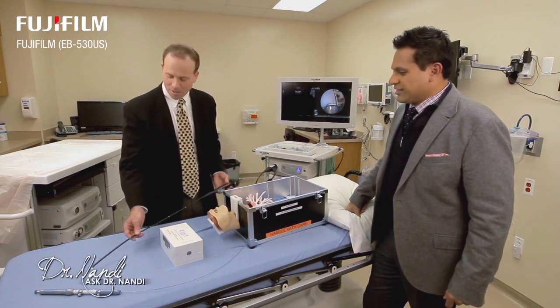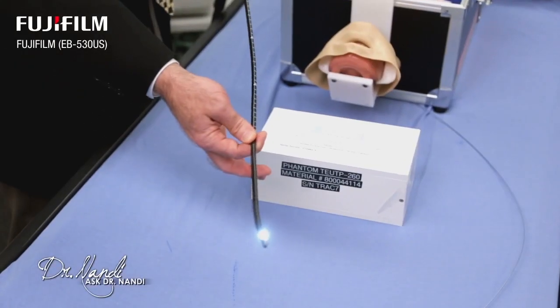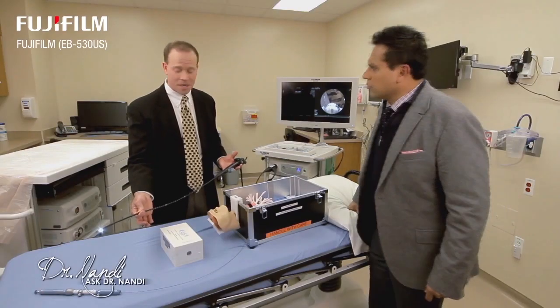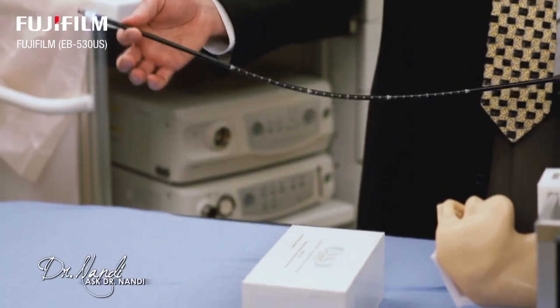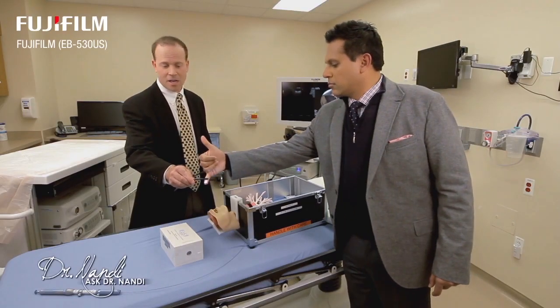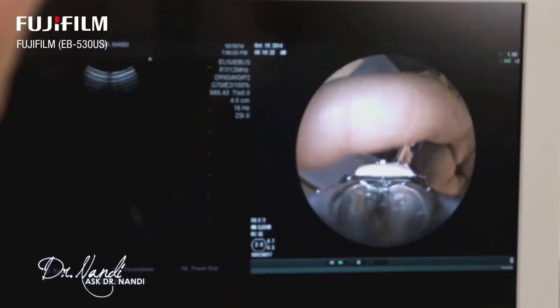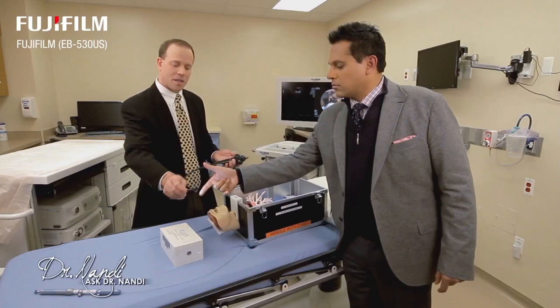It's a very nice bronchoscope. This is the Fuji model of the EBUS, and it incorporates the elements of the standard bronchoscopy, which is basically a video camera at the end of the scope that's about as thick around as a pencil. The camera and the detail on this is remarkable. Looking back at the screen there, we can actually see the outline of your finger, and without the light shining on, it's actually quite detailed. And this is the light source and the lens on this tip here.